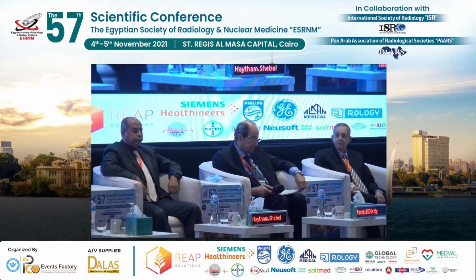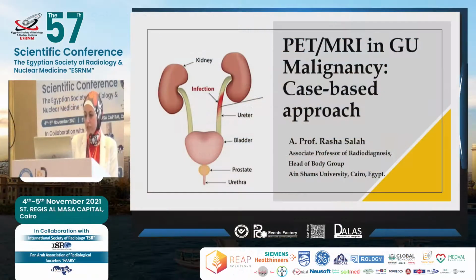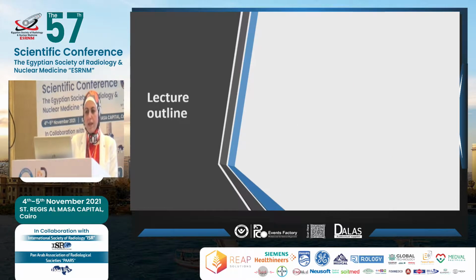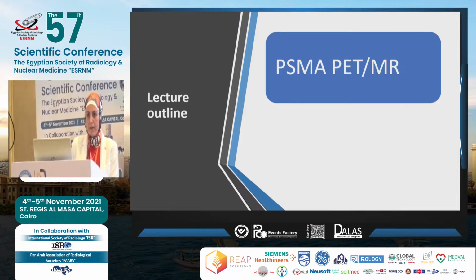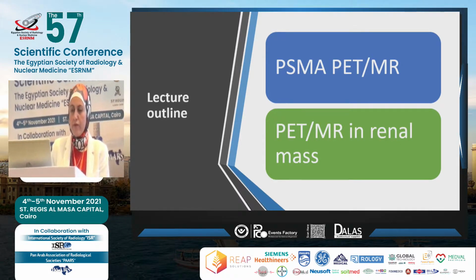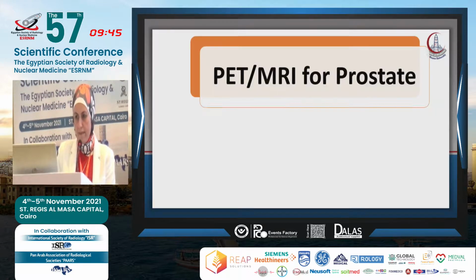Good morning, dear professors and colleagues. It's my pleasure to be here with you. Today we will introduce the new era of PET imaging, which is PET MRI. We are going to narrow this great topic into two major items: PSMA PET MRI for prostate cancer and also FDG PET MRI for renal masses. Let's start with prostate cancer PSMA.